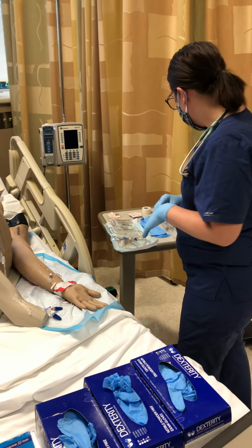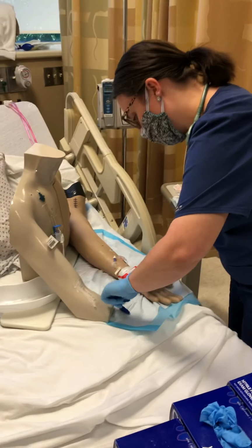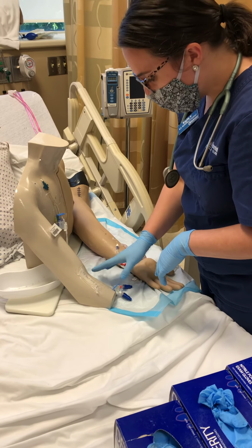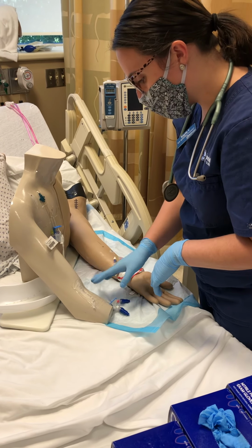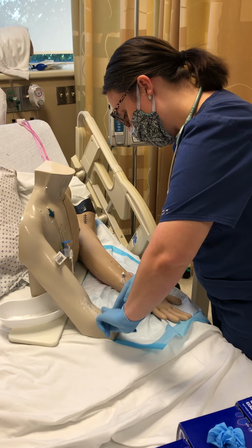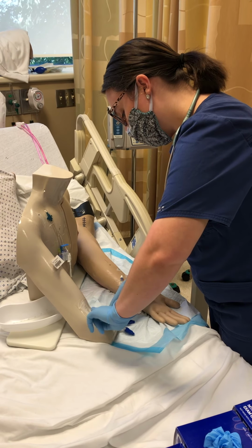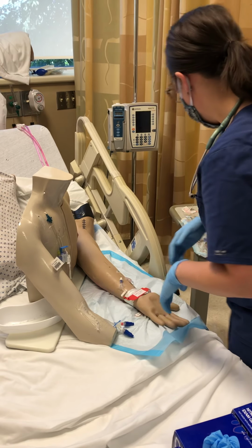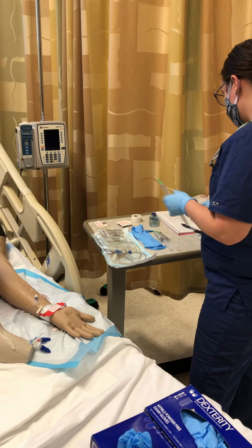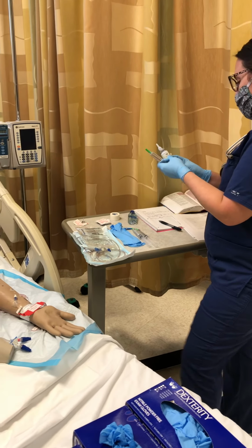Perfect. So next I'm going to check his site here where he has his PICC. I'm checking for redness, edema, ecchymosis, drainage, and amount of drainage. And everything looks really good. I'm going to palpate. Eugene, do you feel any pain at all? He tells me no. Perfect. So I'm going to grab my first saline flush, but before I do that, I'm just going to do my other checks right away. So I have Eugene Williams here.